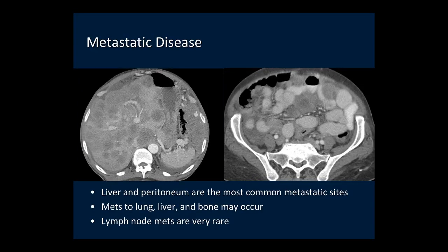The two sites that GIST most commonly metastasize to when malignant are the liver and the peritoneal cavity. Liver metastases appear as hypoattenuating lesions within the liver. Peritoneal metastases appear as nodules and masses in the peritoneal cavity. One exception: metastatic GIST tends not to have abundant ascites, in contrast to adenocarcinoma where ascites is often a predominant feature. GIST can also have distant metastases to the lung, bone, and brain. Lymph node metastases are very rare in GIST.